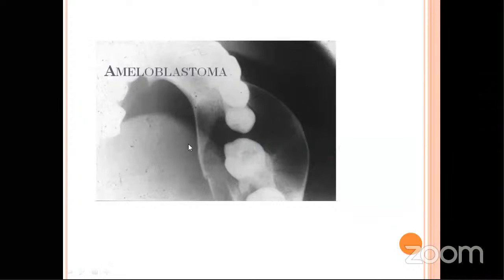So this shows cortical expansion. Okay, so this is a lesion which is seen in the posterior mandible with dislodgement, with alteration of the tooth movement, and the cortex is intact, but there is expansion. Okay, there is expansion, most likely to be ameloblastoma.